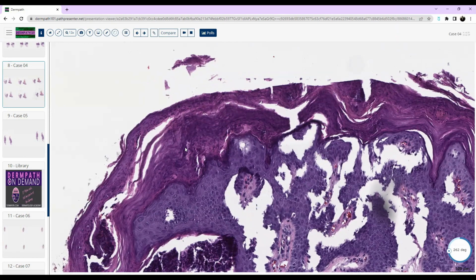No, it would be more diffuse, or more mounds of parakeratosis, yes. Mounds with neutrophils at the summits of the mounds. So remember that. Mounds, little mounds, like little mountains of parakeratosis with neutrophils in them. That's psoriasis. That's a classic form of psoriasis.